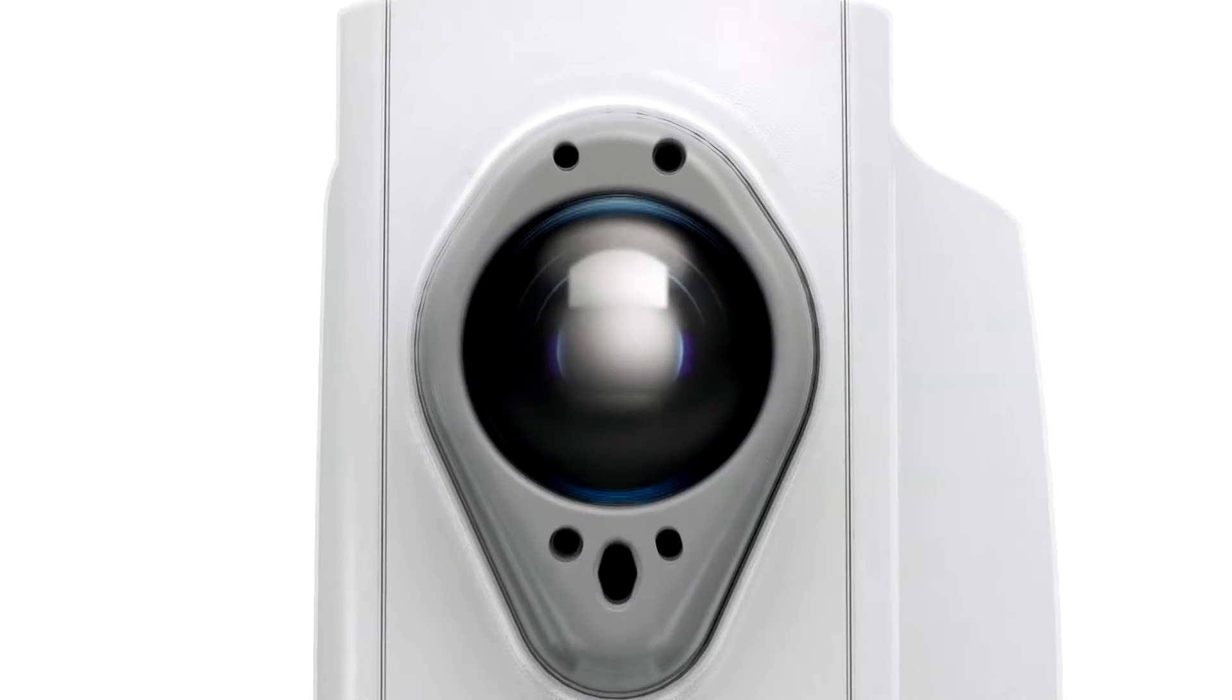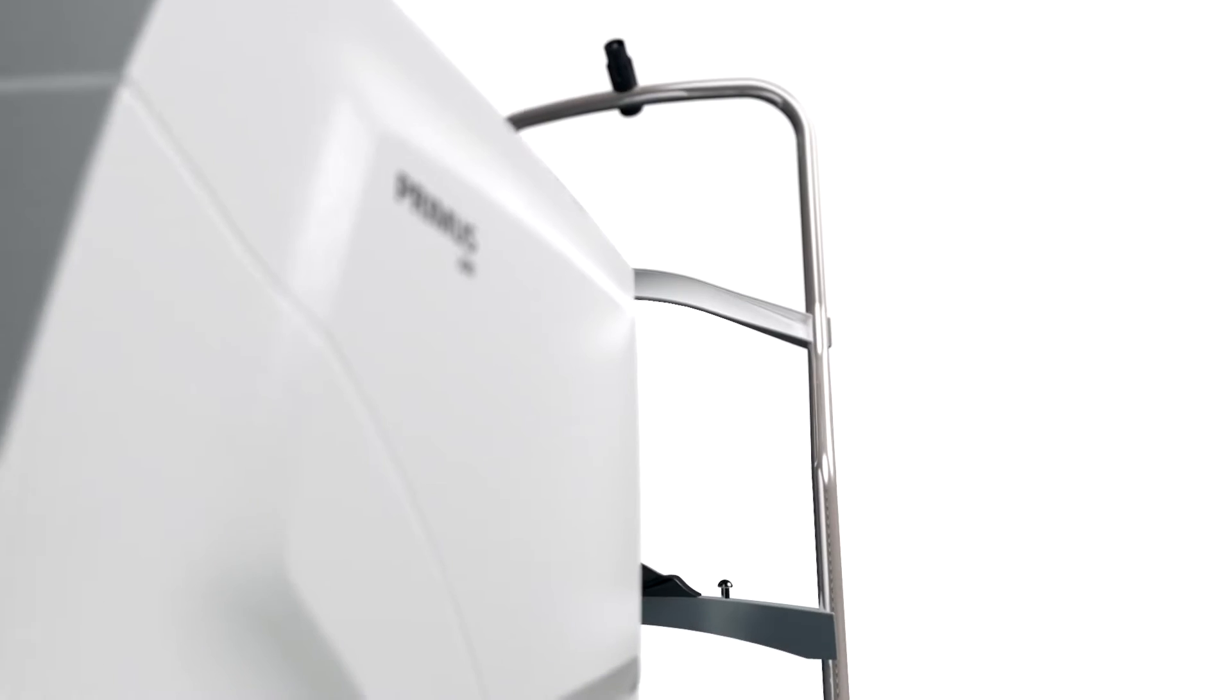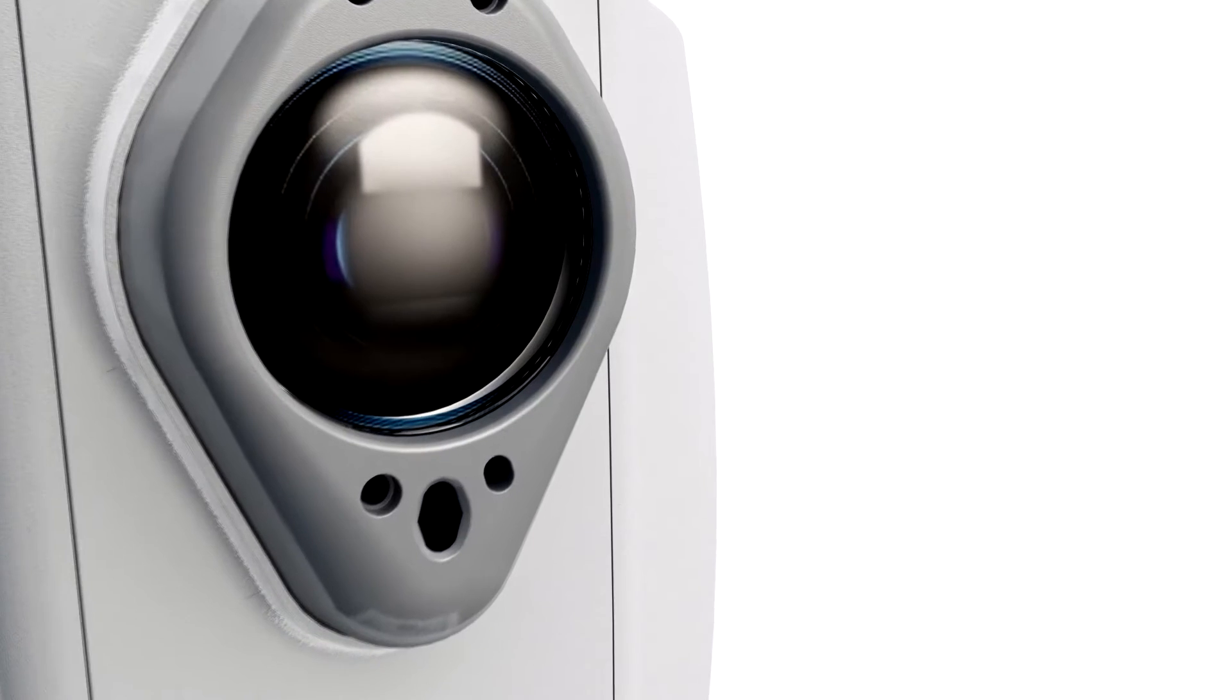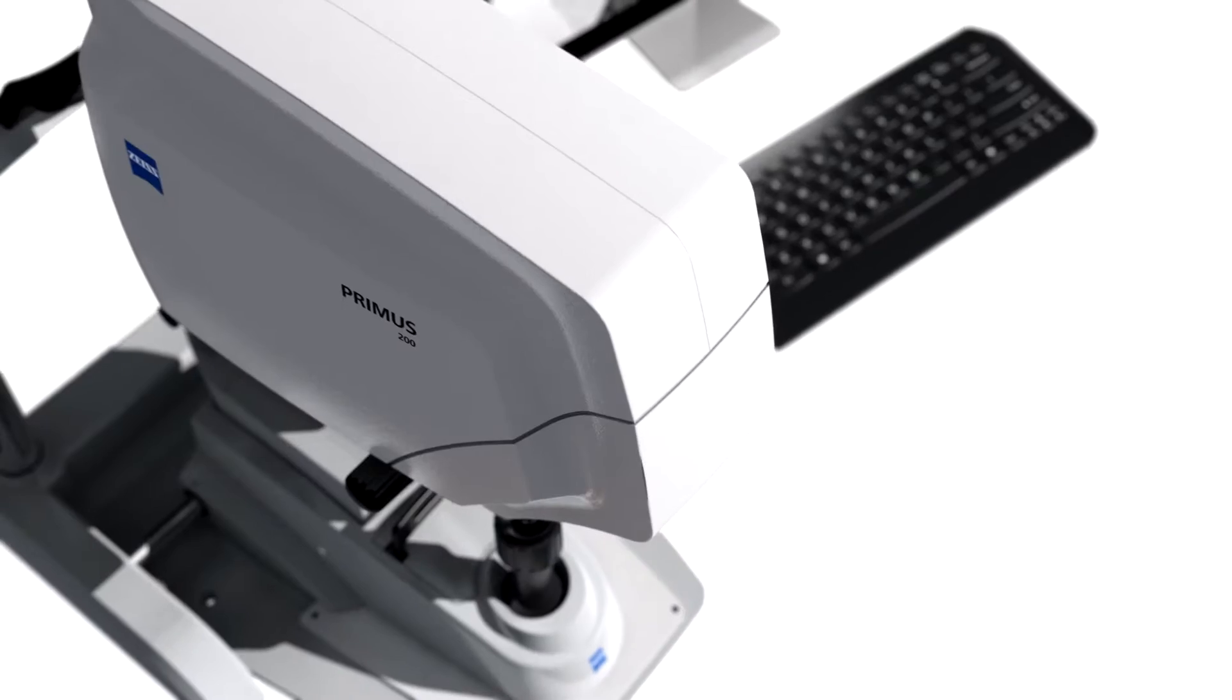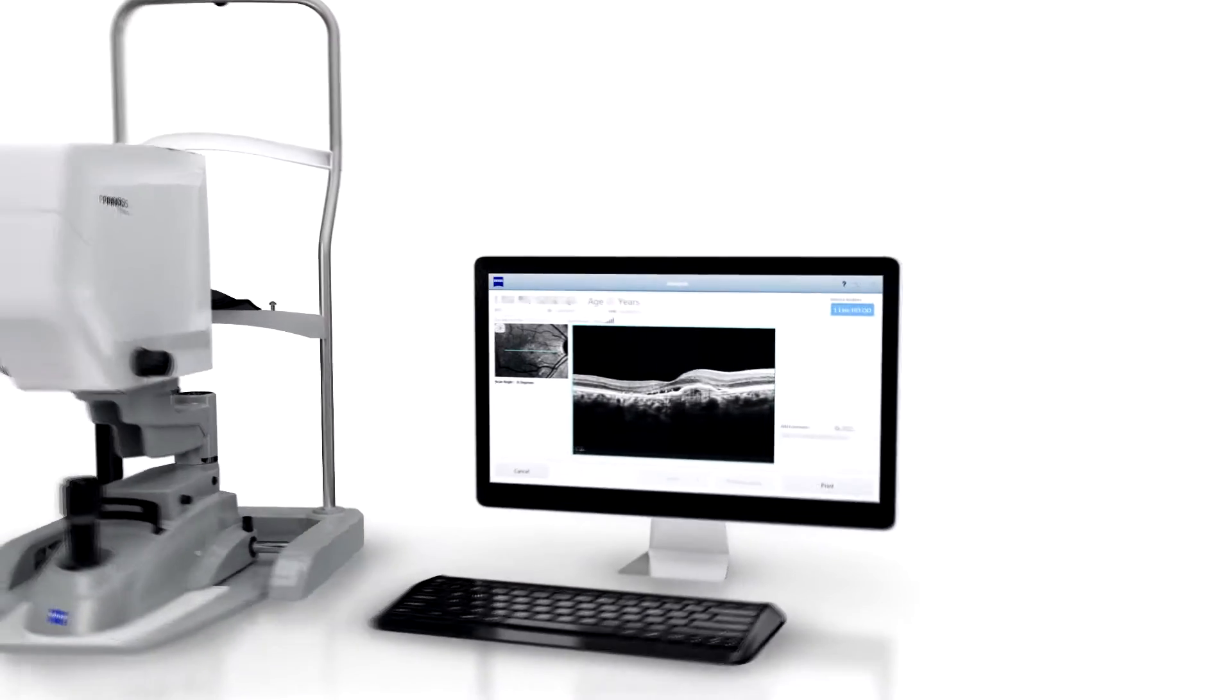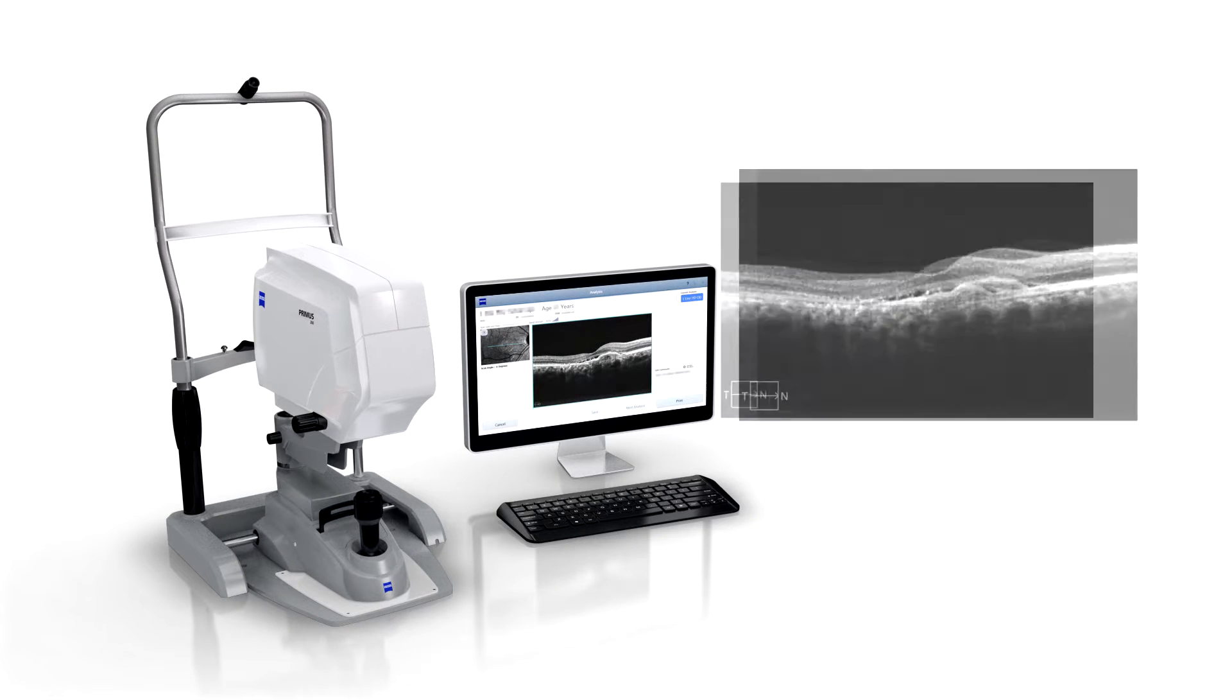Presenting the essential HD OCT. See clear and beautiful cross-sectional images of the retina and anterior segment. Grow your practice with the all-new Zeiss Primus 200.